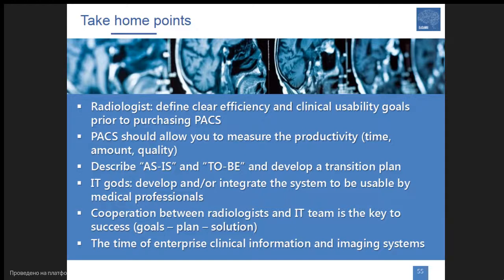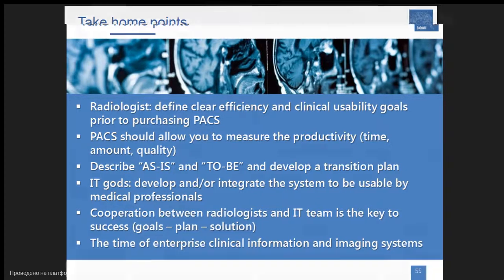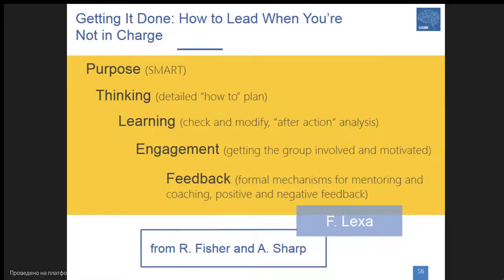The current time is the time of enterprise clinical information and imaging systems, and we shall see more of clinical systems being integrated together with PACS, such as pathology or dermatology and other systems. How to lead the process, how to be a leader of the process, especially when you're not in charge.